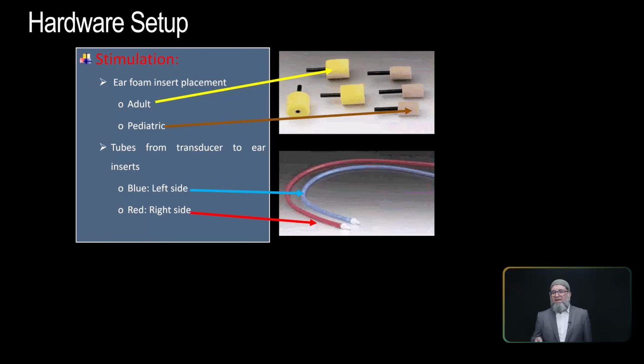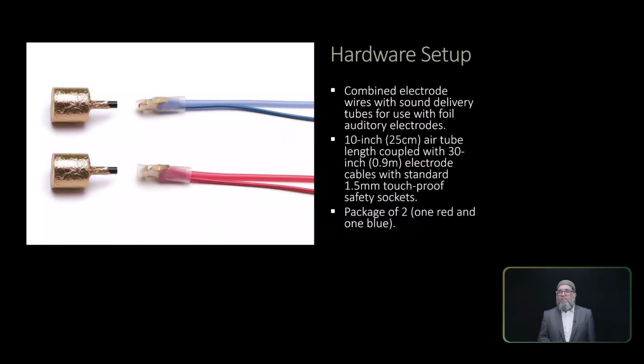These red and blue tubes have a small connector which is transparent or white, and those are reusable, but the tips are disposable. So you should never throw away the tube, only the tips which connect to the tube.